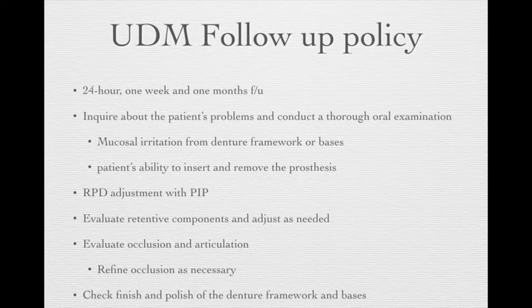So you may have had a good occlusal relationship in the past, but after they started using it, the occlusal scheme may slightly change. So if needed, you also need to do some adjustment. And finally, try to finish and polish the denture framework and bases smoothly, so they will not easily accumulate food debris or bacteria.